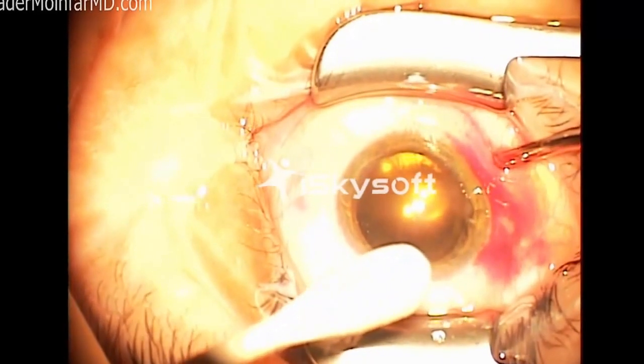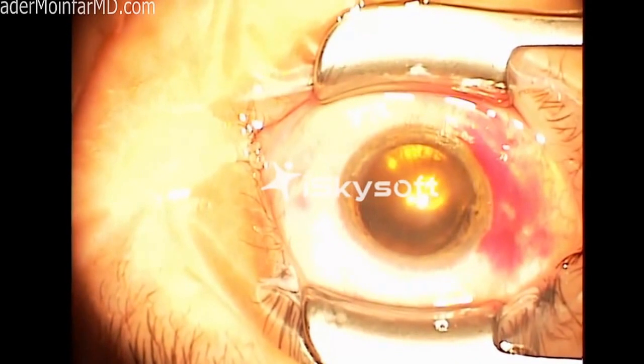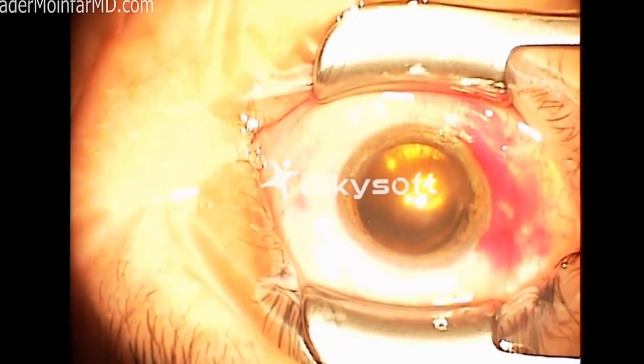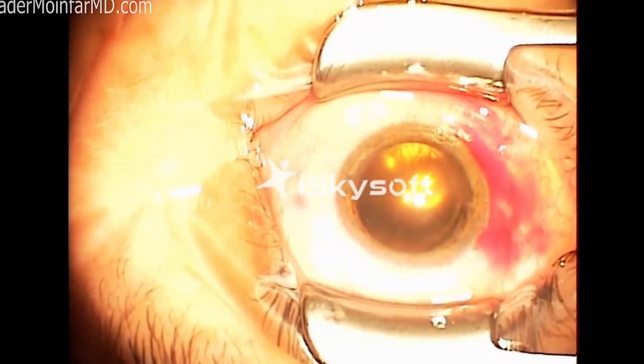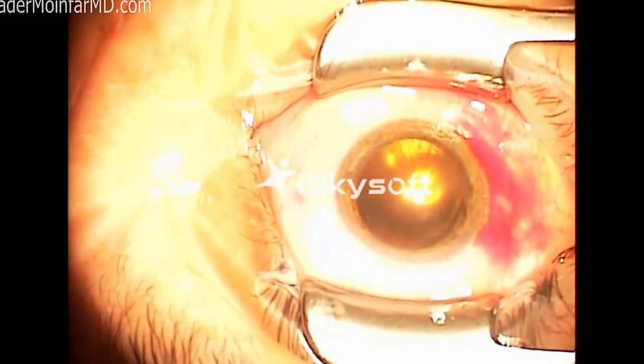So basically this is a start to finish in real time, a pars plana vitrectomy with endolaser for the treatment of proliferative diabetic retinopathy in a patient with a vitreous hemorrhage and traction retinal detachment.